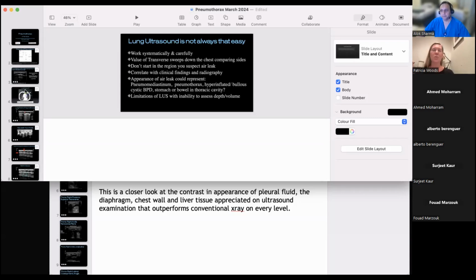It's a helpful tool. Yes, you can diagnose. Yes, you can weigh up, and it adds clinical information. Serial scans, of course, can help you. And I love to show families, if we have intervened or not, that this is the problem. This is what's happened with time.